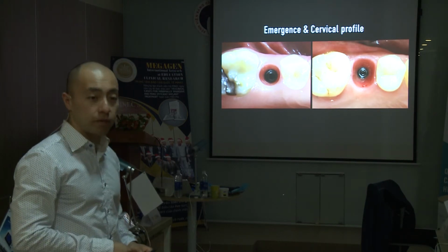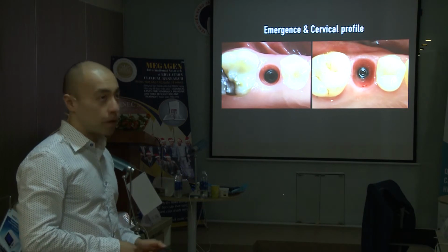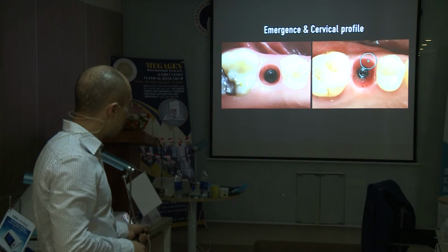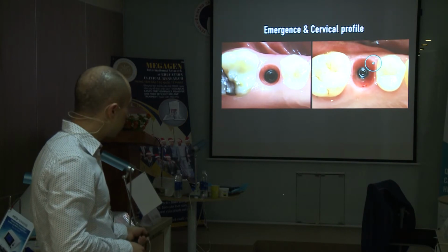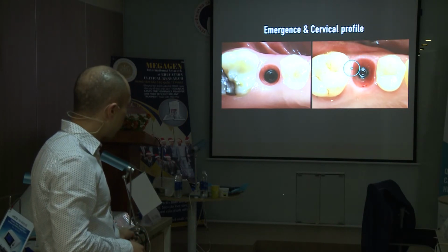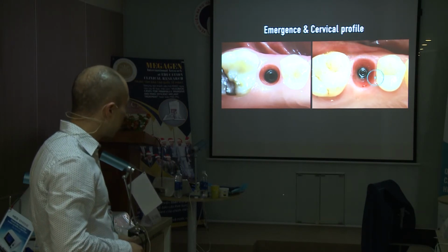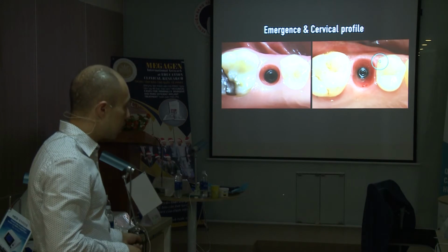Well, I tell them they don't. Because you see why it's so red. There is a connection of the crown with the soft tissue. So there won't be any food substance or plaque in here.